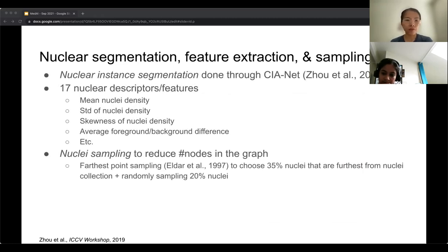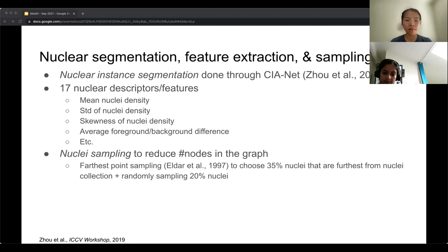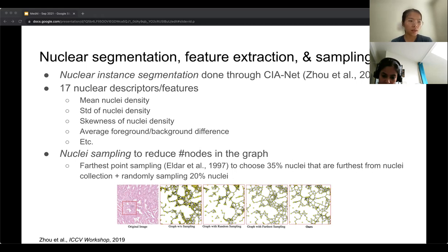Nuclear segmentation was performed through an existing model called CIA-Net, and 17 nuclear features were extracted, such as the mean, standard deviation, and skewness of nuclear density. Because a whole slide image can contain many nuclei, nuclear sampling is performed to reduce the number of nodes, using a combination of furthest point sampling and random sampling. The second column shows the dense graph without sampling, the third shows random sampling, the fourth shows furthest point sampling, and the last shows a combination of both.